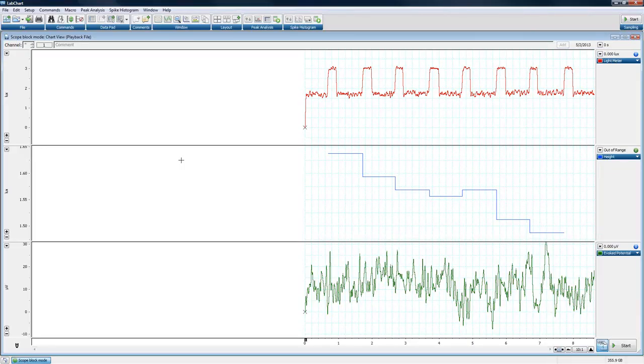In channel 1, we have a light meter that is measuring the amount of light being shined into someone's eye. In channel 3, we're recording an evoked potential from the visual cortex, and that cortical potential is recorded alongside the light that's being shown to someone.